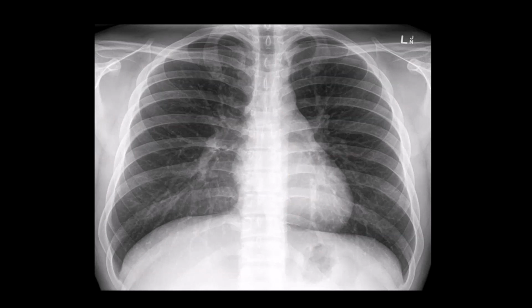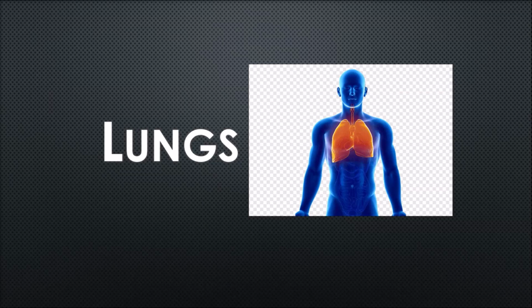It can be looked into first. Coming up, a systematic way of reading an X-ray can simplify things for you, over the next few videos in the coming weeks. A chest X-ray is done in 3 views.